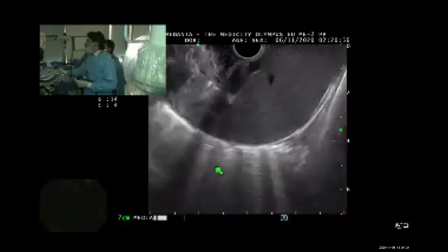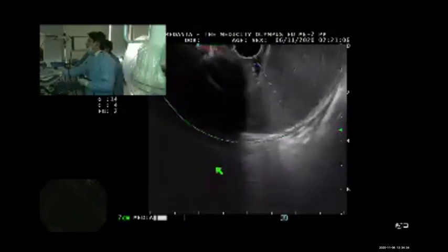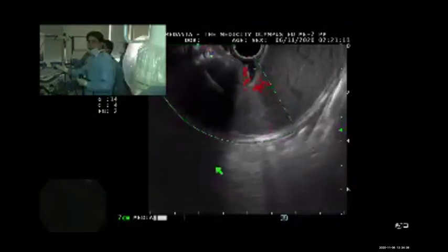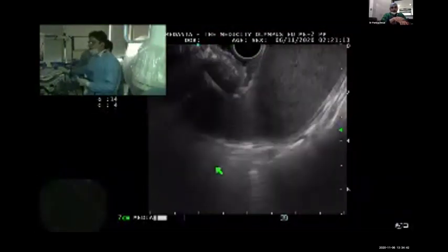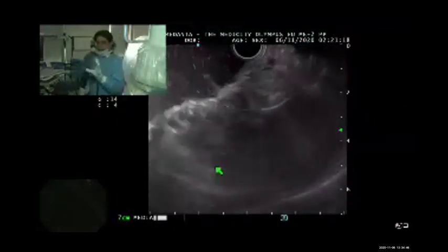You can see here, if I focus it very nicely, the complete varix appears to be obliterated. This is one of the feeders, and you see there is shadowing of the coil and no signal. Is the US image available? Yes. The second advantage is that under fluoroscopy we can show again the glue cast is there, the coil is there.